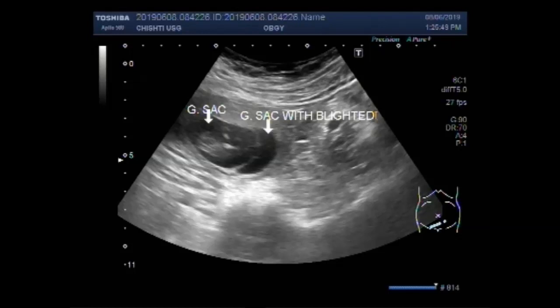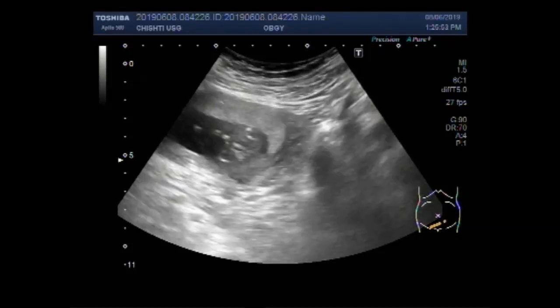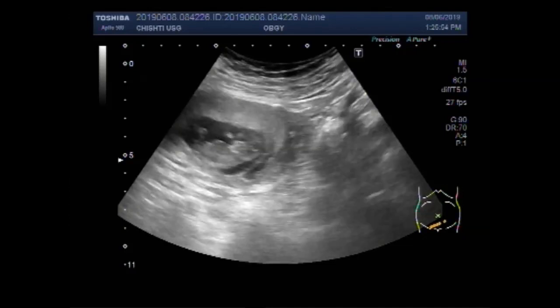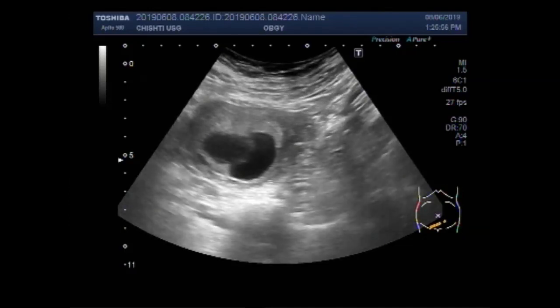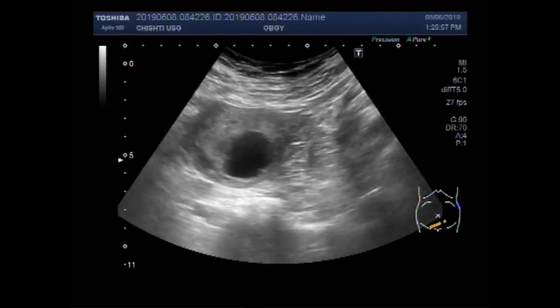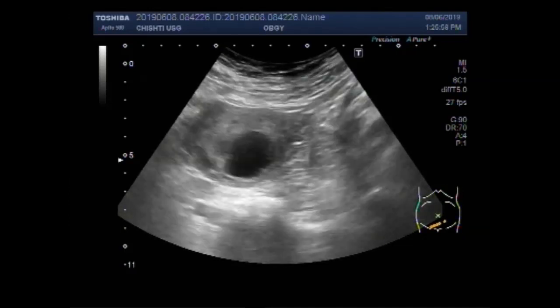No POC — no products of conception are seen. This is the anembryonic gestational sac.